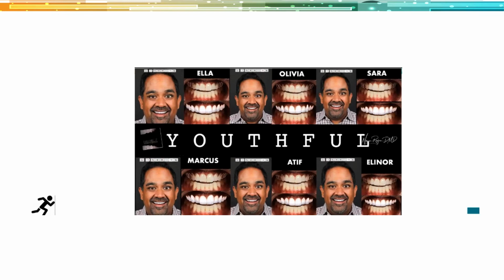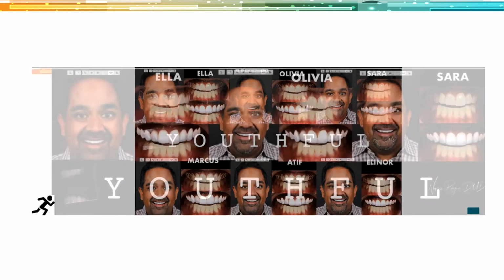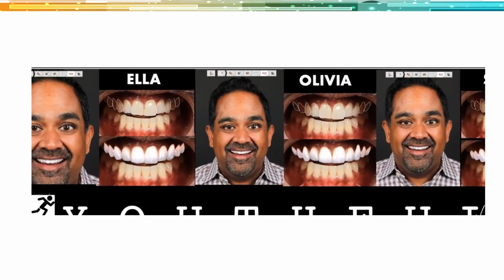And what I'd learned by doing this exercise on myself is that actually the aesthetics of smiles is much more unisex than I originally thought. Some of these smile libraries are female patients, some of them are male patients, and so I don't even show the patient whether it's male or female. And we can really start to see that you can characterize these smiles in almost an infinite amount of ways.